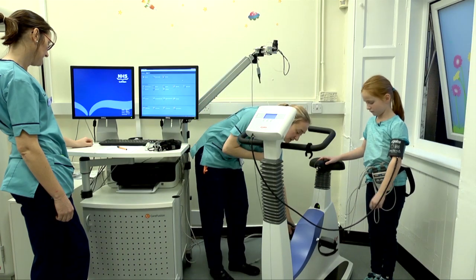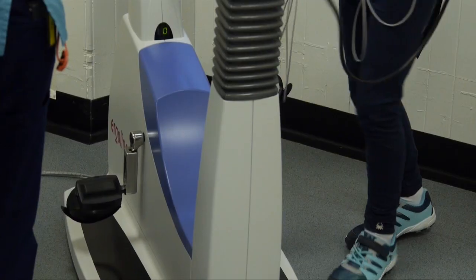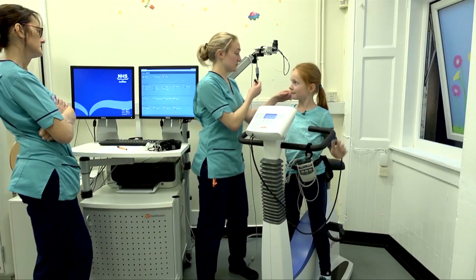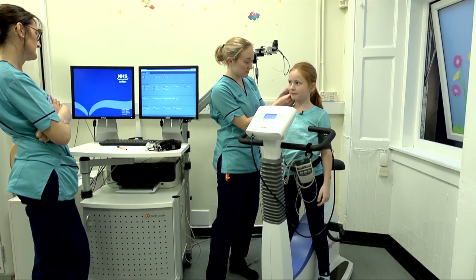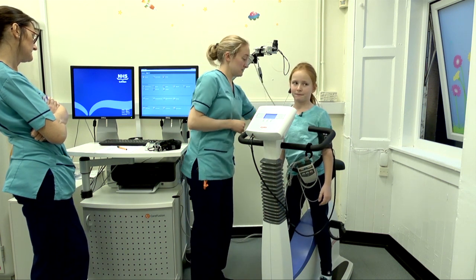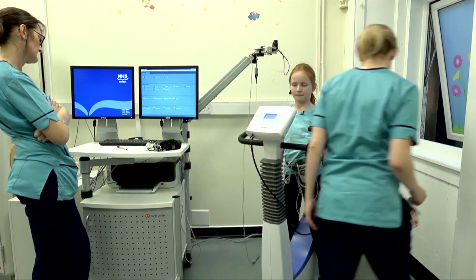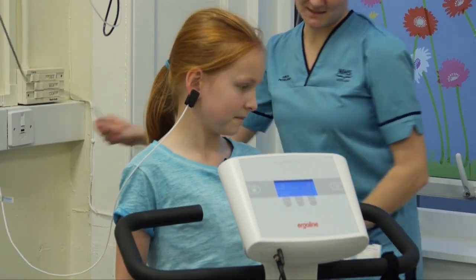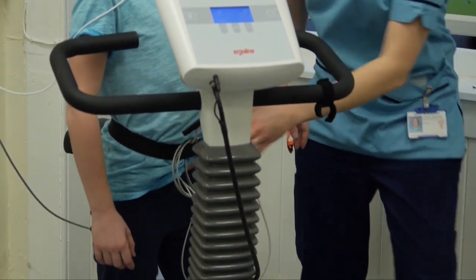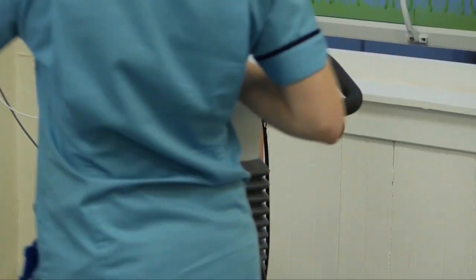Could I get you just to stand with your feet on the black bits either side? We're going to put this on your ear so you can see what your oxygen levels do. And then we'll attach them to these wires. That's going to tell us how your heart's working throughout the test.